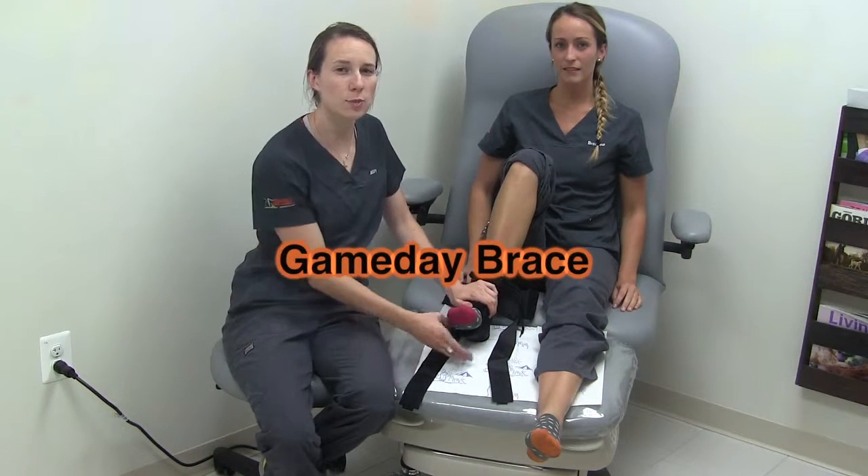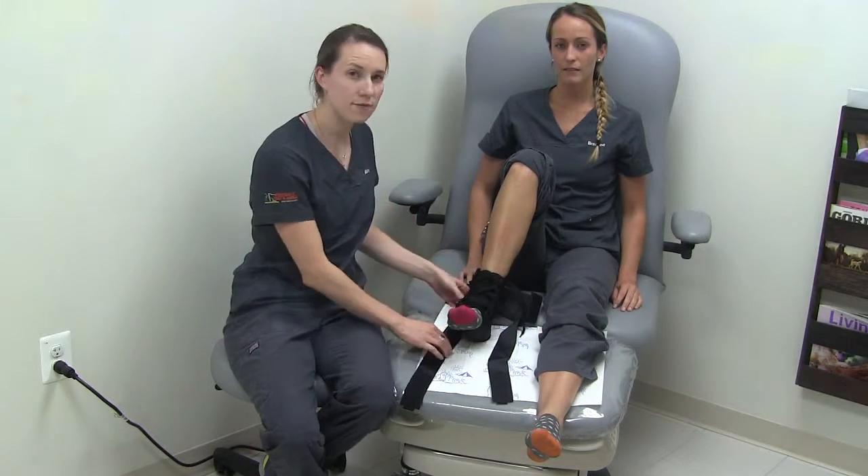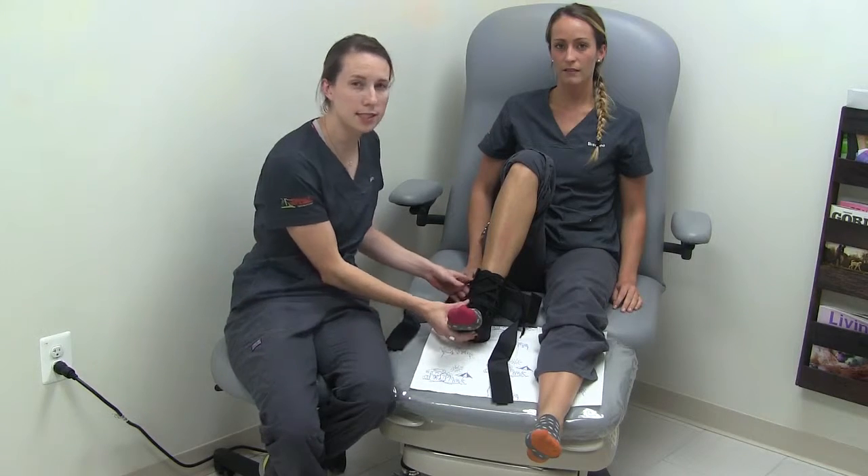The game day brace provides arch support and ankle stabilization as well as compression. First, un-Velcro all the straps and slide your foot into the sleeve.